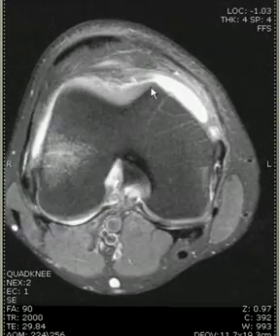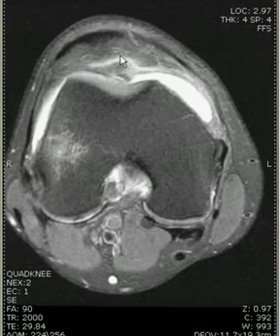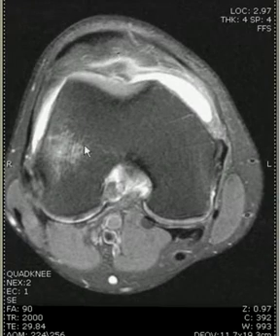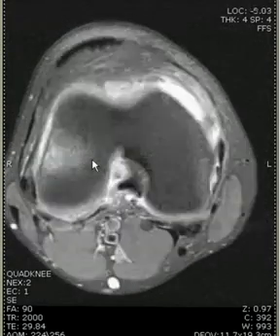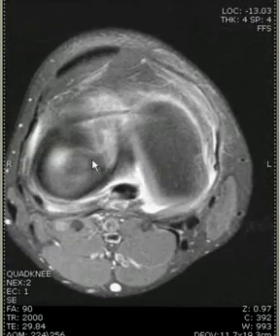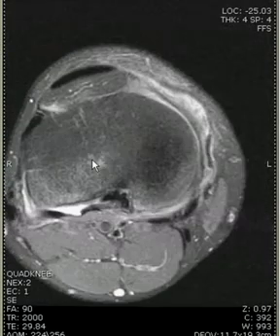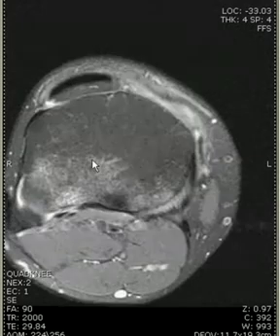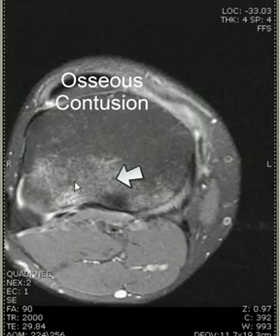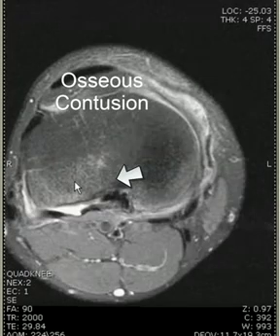The patellar cartilage is normal in both the lateral and medial facets, and the trochlear cartilage is also normal. Note that the patellar tendon is slightly lateral in position, likely representing a patellofemoral tracking abnormality, but no underlying hyaline cartilage defect is seen. Again we can see the contusion pattern in the posterior lateral tibia.